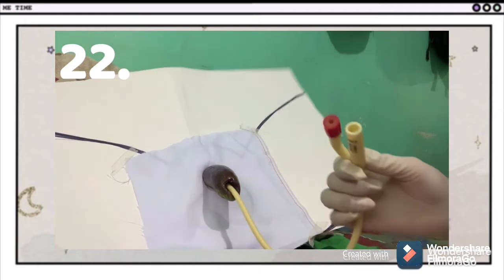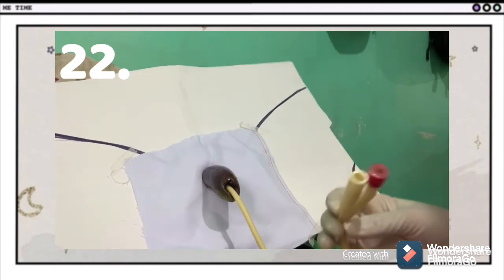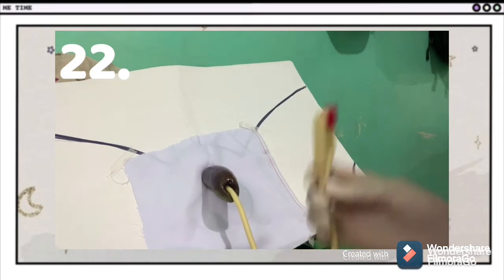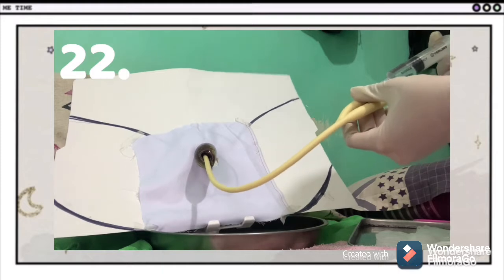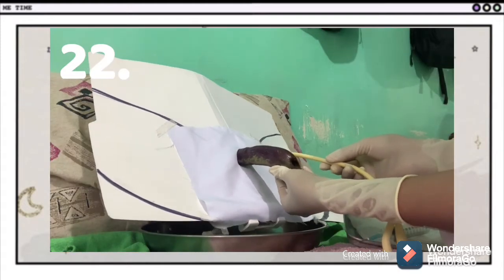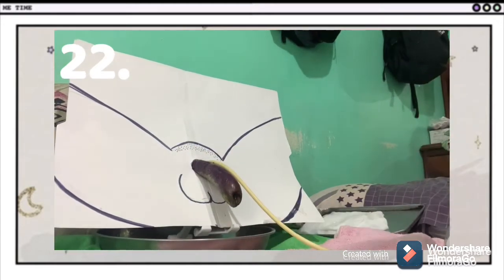So, if a Foley catheter is used, introduce 5 cc. Gently pull the catheter until the retention balloon is snuggled against the bladder neck. Remove the fenestrated drape. This creates a balloon to ensure catheter retention. Maximize continuous bladder drainage. Proper attachment prevents trauma to the urethra and meatus from tension on the tubing.